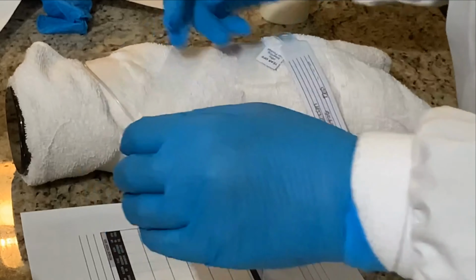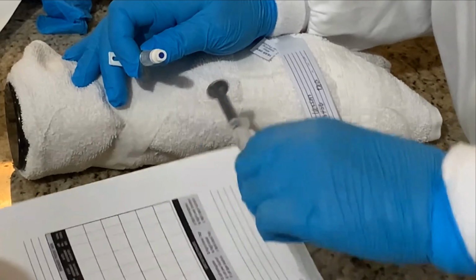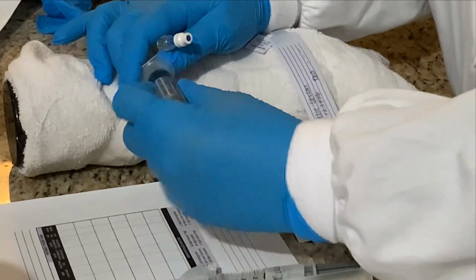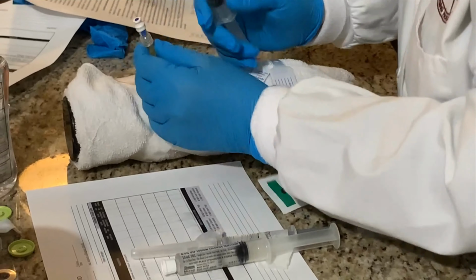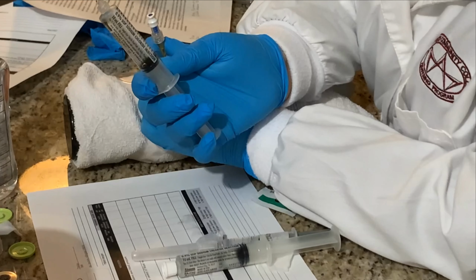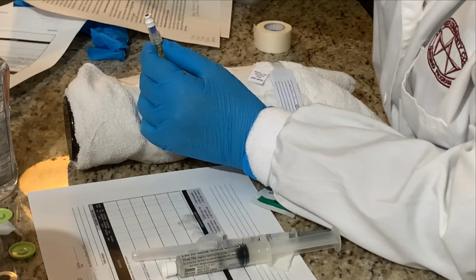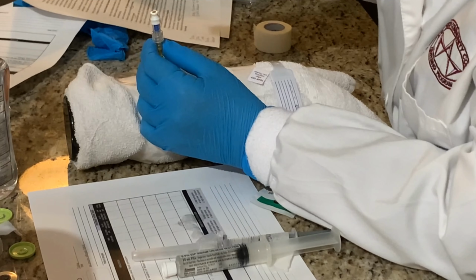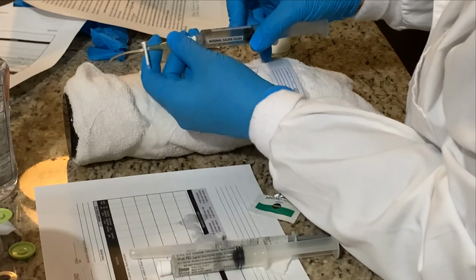Okay, and this is why I don't want it to touch anything. I've got everything prepared so that I can kind of hold this up. So now I'm going to give 3 mLs of, and in your syringes, it has 10 mLs. So you'll see a little air bubble at the top. You can pull that out. And because it's 10 mLs, I'm going to push it up to 7. So I'm going to connect this.